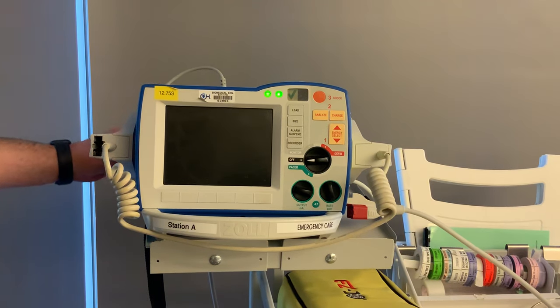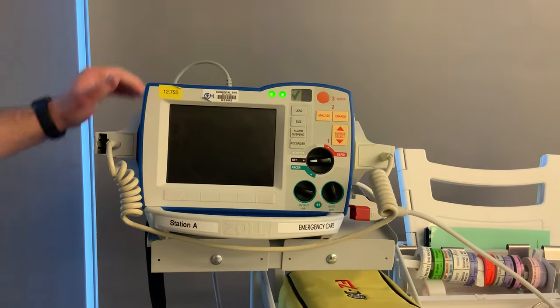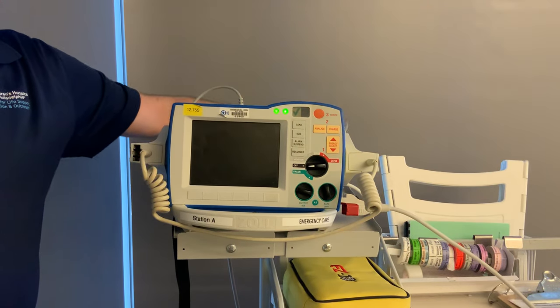On the back, on one corner, you have your three leads — we're going to talk about them in a little bit and why they're important. On the other side, you have your end-tidal CO2. So if your patient is intubated and on end-tidal, you're going to connect this, and that's over there for you guys to use as well.